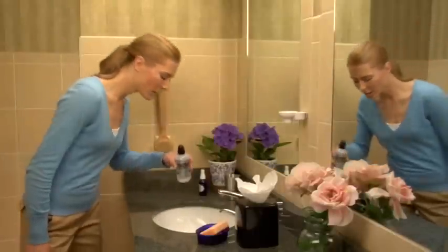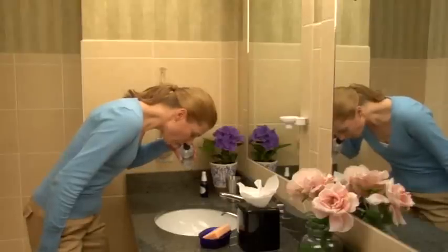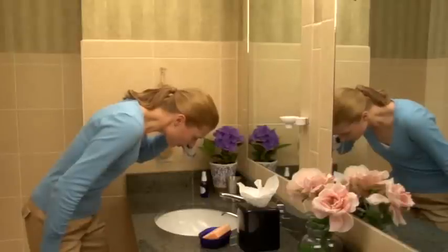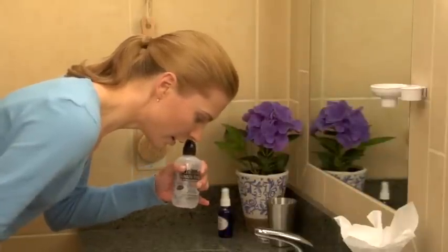Standing in front of a sink, bend forward comfortably and tilt your head down. Keeping your mouth open without holding your breath, place the cap snugly against your nasal passage and gently squeeze the bottle until the solution starts draining from the opposite nostril or from your mouth. Keep rinsing until at least ¼ to ½ of the bottle is used for a thorough wash. Do not swallow the solution.